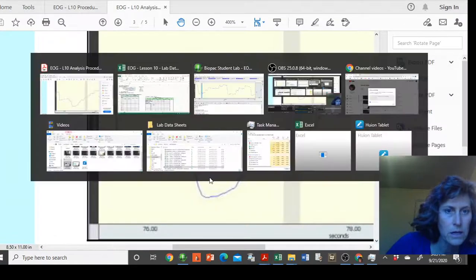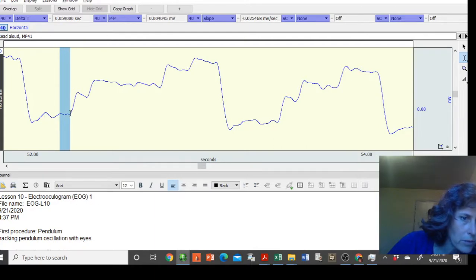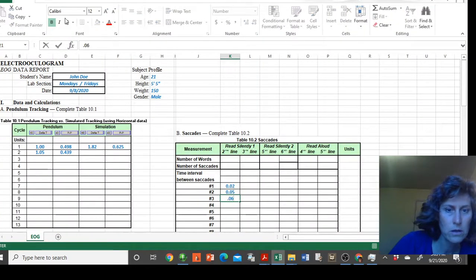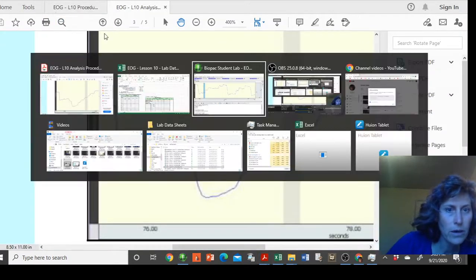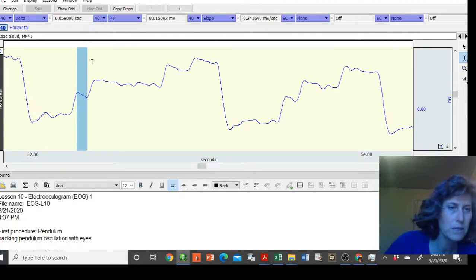Okay. And it's kind of jerky going here. We do our best. I'm going to call that one. That's 0.06. And on we go. And now I think we're going to get a big dramatic one here. So we start here and we go there. That's 0.06. Not very exciting, but that's... And we're going to continue.